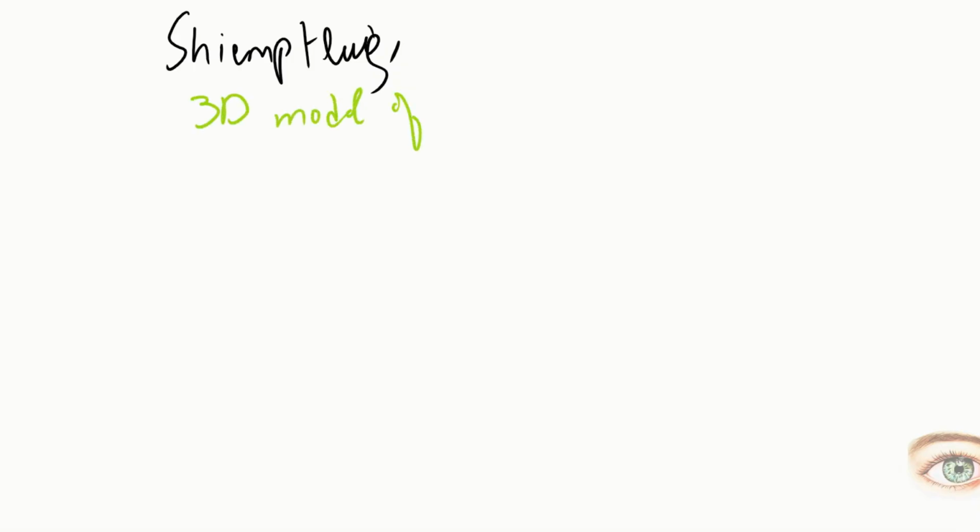Now, after that, more advancements took place, and the scientists decided to make a new technology, which is called the Scheimpflug technology. Now, what happens in this? It creates a 3D model of the cornea, right?